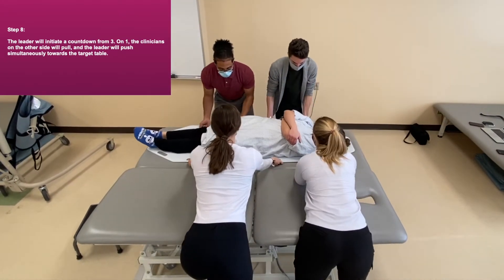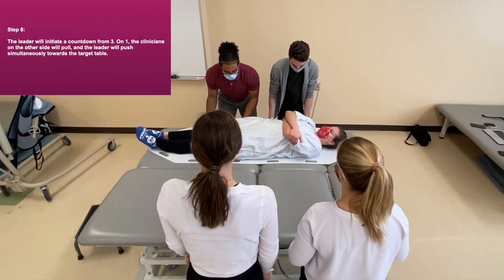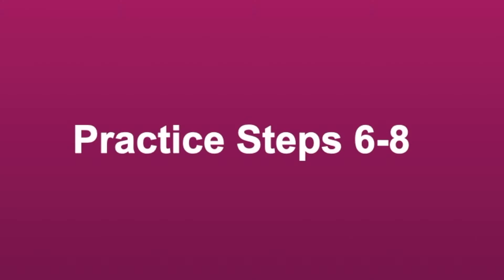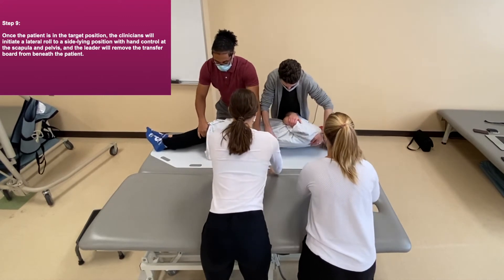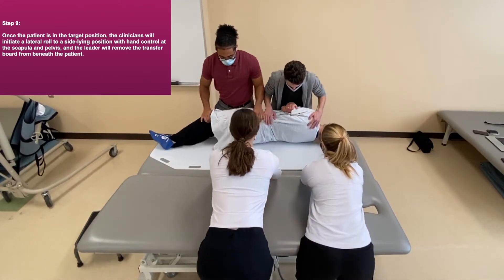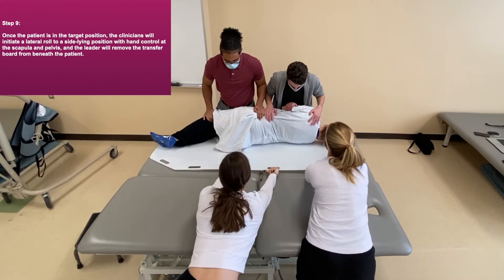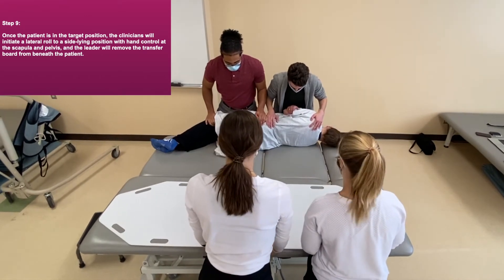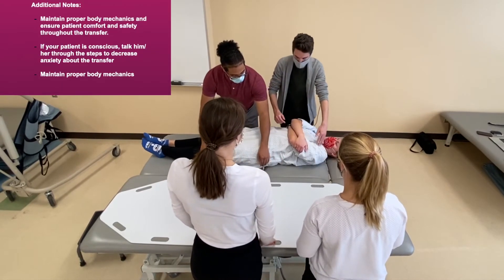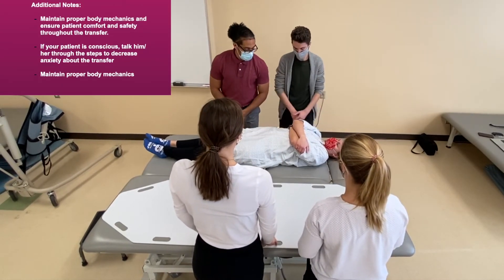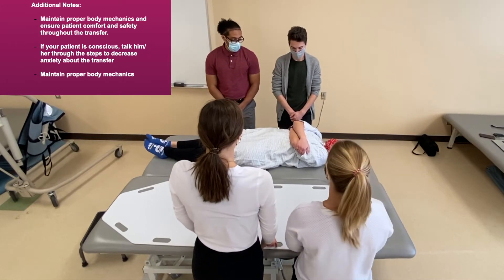The leader will initiate a count from three. On one, the clinicians on the other side will pull and the leader will push simultaneously towards the target table. Once the patient is in the target position, the clinicians will initiate a lateral roll into a sideline position with hand control at the scapula and pelvis. The leader will remove the transfer board from beneath the patient. The clinicians will then carefully roll the patient back into a supine position. It is important to maintain proper body mechanics and ensure the patient is comfortable and safe throughout the entire transfer.